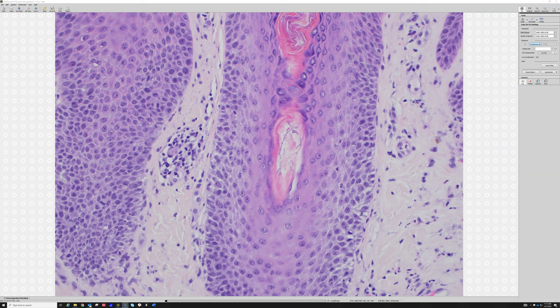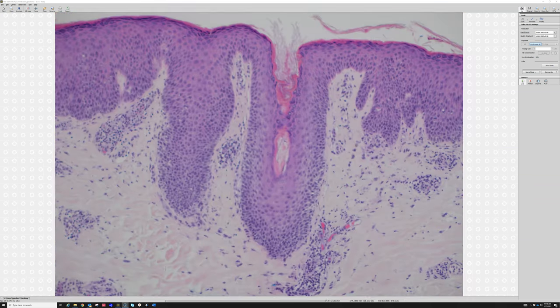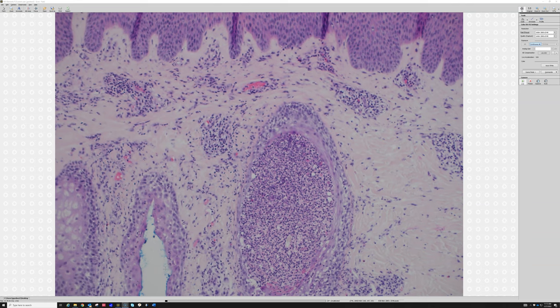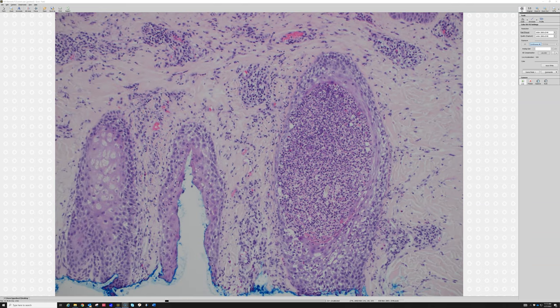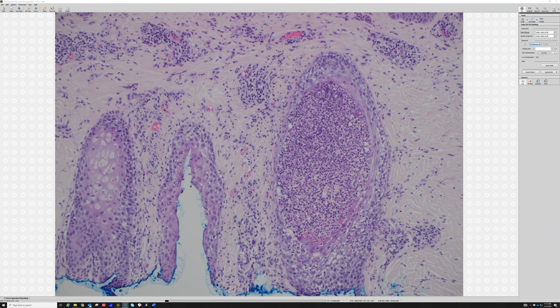There's the fungus in the follicle. Now look over here — we see another follicle, but this one is filled and distended with neutrophils, and it's got some inflammation in the dermis around it. This is a pustular folliculitis or suppurative folliculitis.